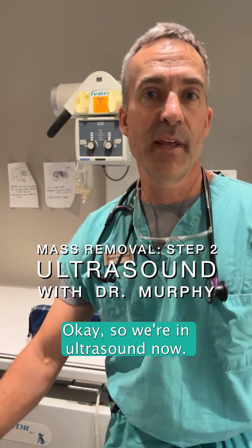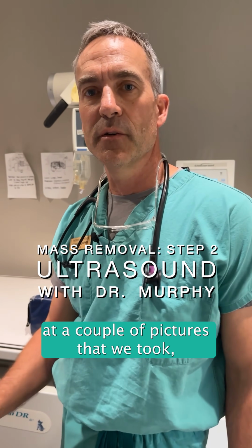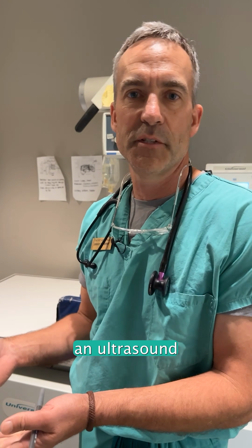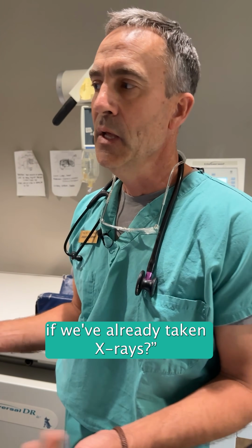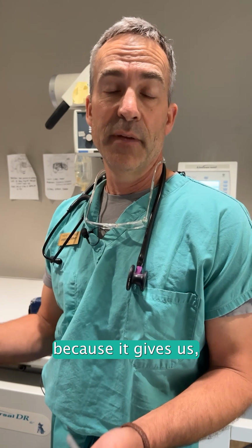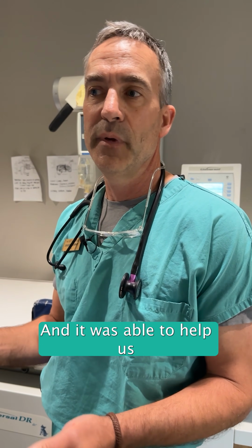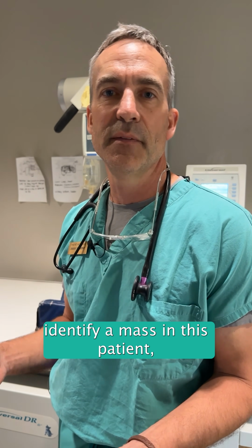Okay, so we're in ultrasound now. We're going to look at a couple of pictures that we took. And so the first question would be, why do we need to perform an ultrasound if we've already taken x-rays? Well, an x-ray is great because it gives us size and shadows, and it was able to help us identify a mass in this patient.